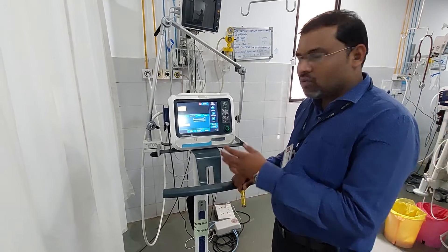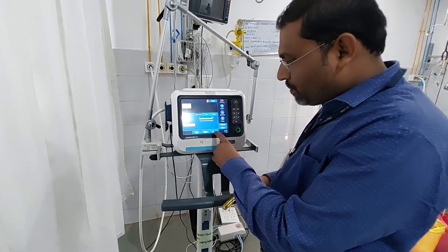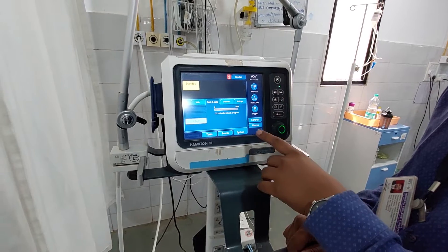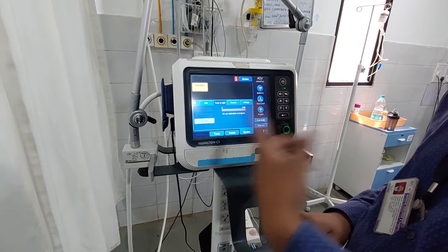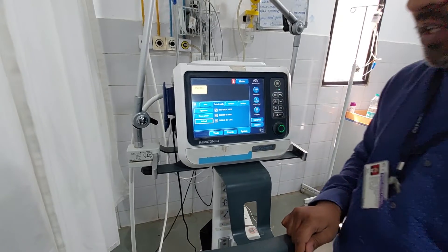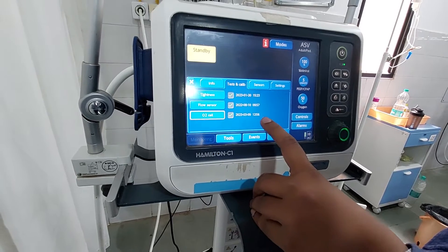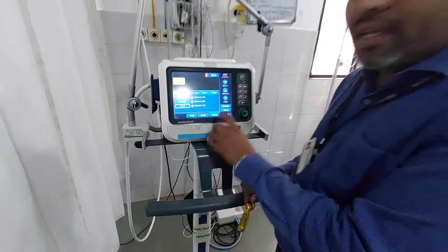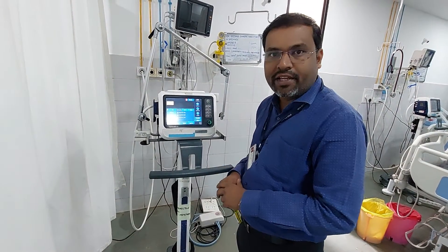To recap how to enter calibration mode: press on System, then Test and Calibration, and in Test and Calibration there will be O2 cell — click on it and the machine will automatically start to calibrate the O2 cell. Now the O2 cell is calibrated and you can observe today's date is 9-3-2023, time 12:56, meaning your O2 cell is working properly. In this way you can replace the O2 cell in the Hamilton C1 machine. Thank you.